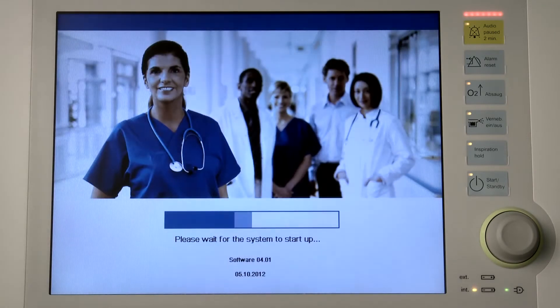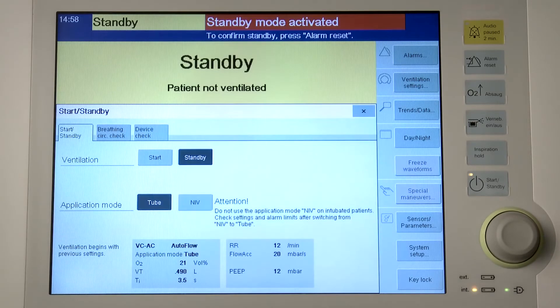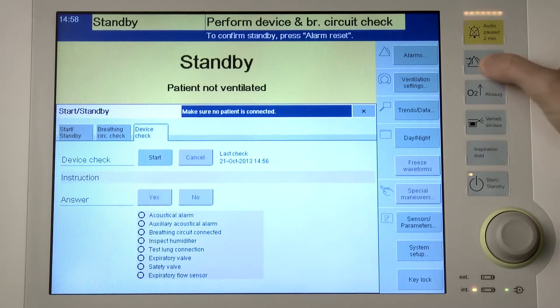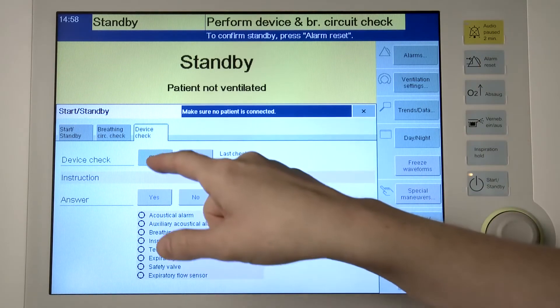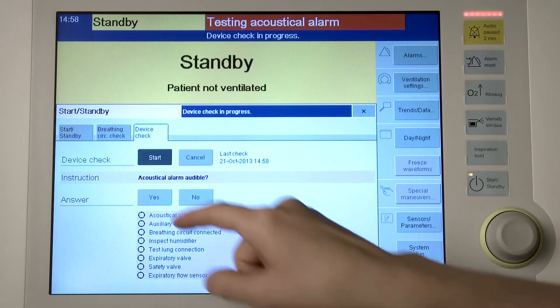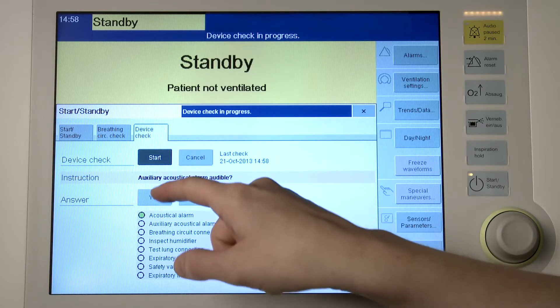Turn on Savina 300 and subsequently press the start standby key. Then touch the device check tab. There, Savina 300 displays the individual test steps in a list. Touch the start button and confirm with the rotary knob. Answer the questions in the instruction field by touching the buttons yes or no.